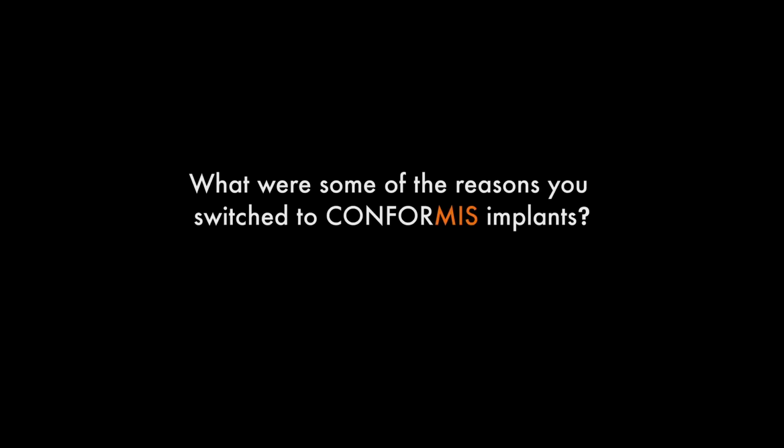One of the deciding factors in choosing to move over to the Conformis knee was patient-reported outcomes. What I'm finding is the patients are much happier than they tend to be with a normal standard knee. The Conformis knee fits not just the size but also the shape and the contours of the patient's own knee, so it feels more like a normal knee. So we're seeing better patient outcomes in terms of satisfaction and function.